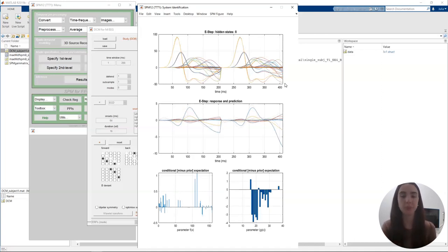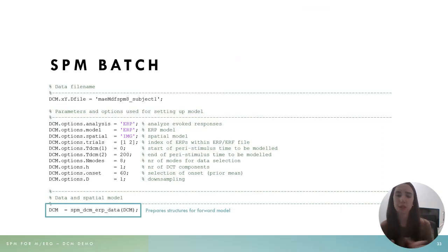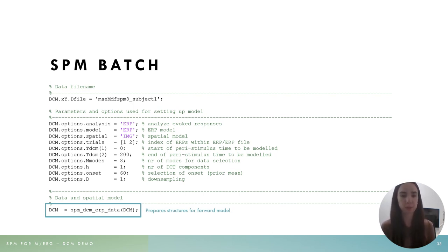At the bottom we have our parameters — neuronal model parameters and spatial model parameters. This can take a while to run, from a few minutes to a few hours depending on your model. In the meantime, I'm going to show you a different way to run a DCM model. The GUI is very useful when you're starting to learn DCM and exploring all the options. But in some cases it may be more useful to use an SPM batch or script to run your models — this is exactly the same process but written in code instead of clicking through the GUI.